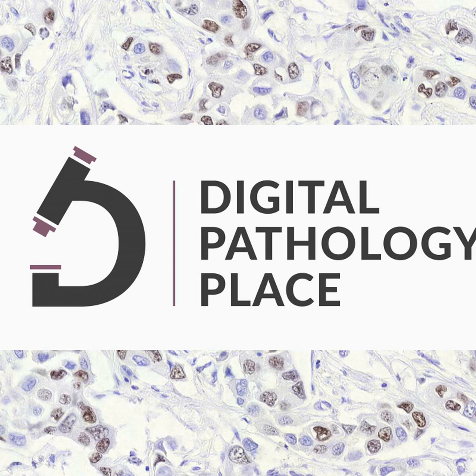In fact, that's not how I work as a radiologist. If I'm looking at, let's say, a trauma study, patient gets in a motor vehicle collision, and I have a CT scan of the chest, the abdomen, and pelvis, and I'm looking for different pathology. And one of the first things I see is that they've got a fracture of the first rib. When I see a fracture of the first rib, that tells me, because of the education and experience I've had, to look into the lungs, look into all kinds of things, because it's a very high speed injury.